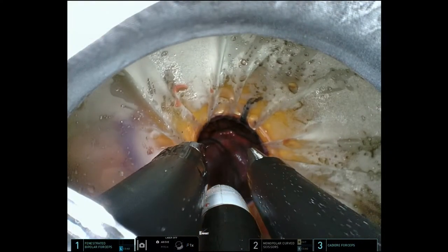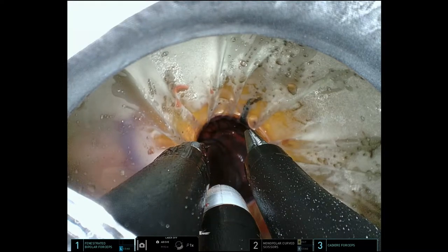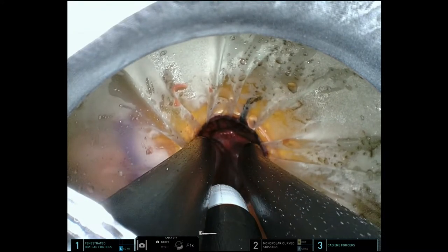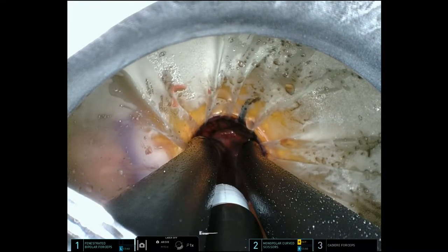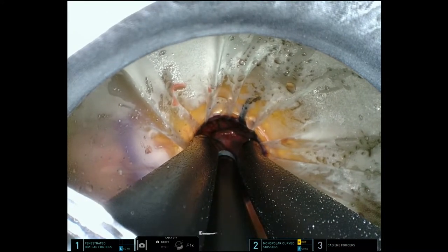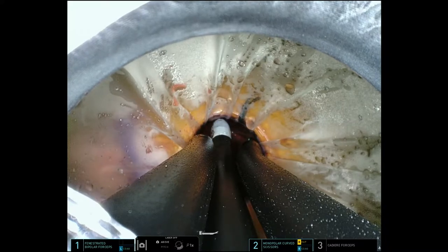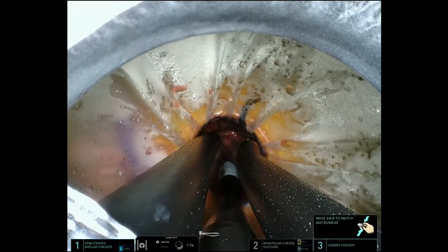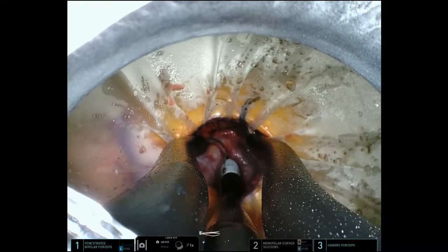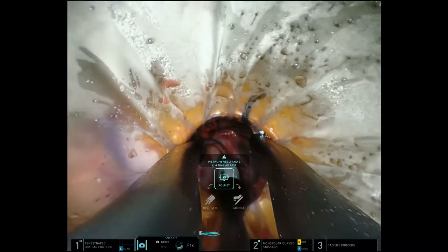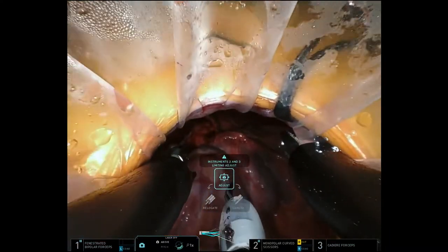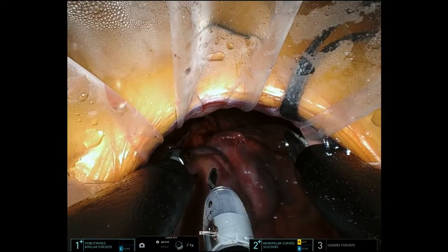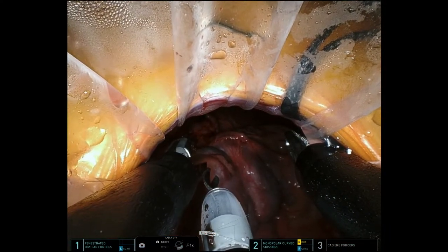When you look at the camera and bring the instruments in, this is what you see. These are introducing and fanning out the right, left, and inferior arm. In this situation, the camera is at the 12 o'clock position, and these instruments are at the 3, 6, and 9 o'clock positions.